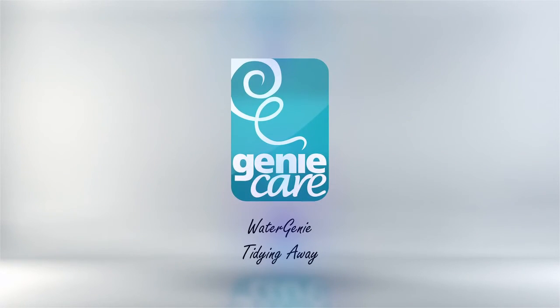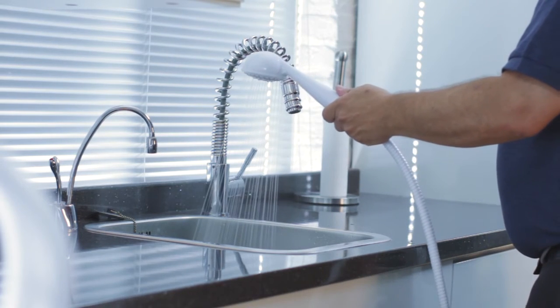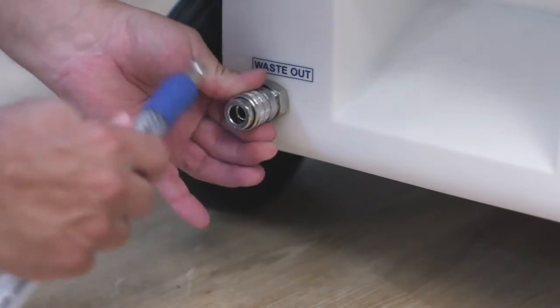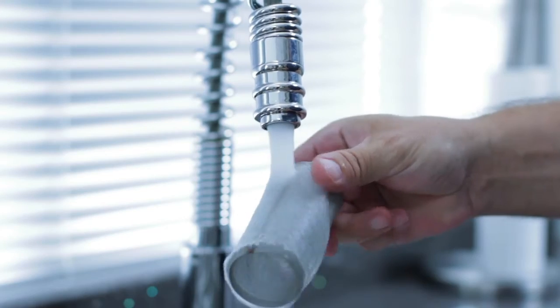Tidying away. Disconnect the Watergenie unit from the shower tray and roll it to the drain. If there is any remaining clean water in the tank, release this down the drain. Disconnect the waste hose and drain any fluid in the hose down the drain. Unscrew and clean the cream coloured filter — this must be done after every use.